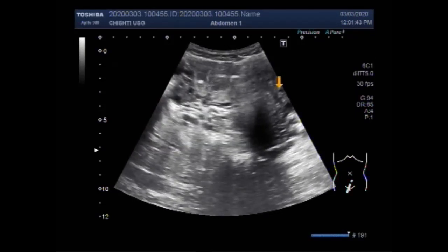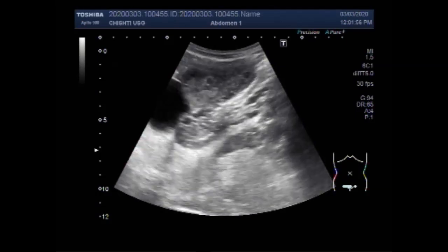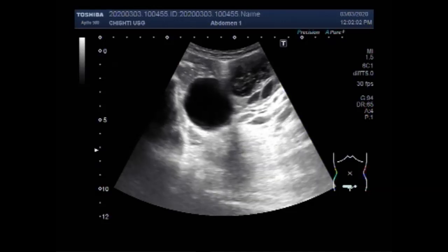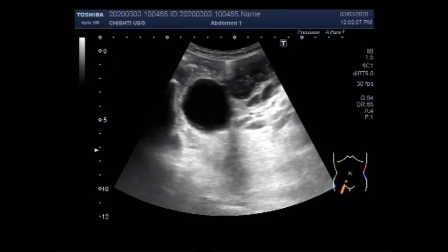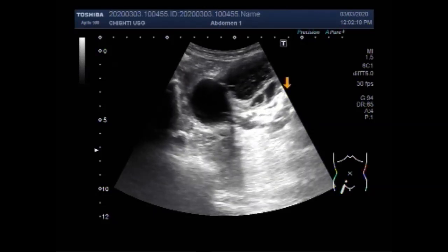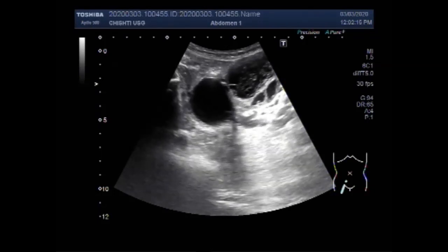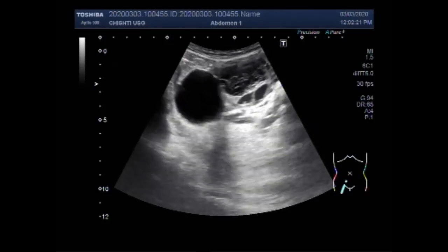This is the uterus and this is the left ovary. Both cysts are seen on the left side in the left ovary. One has a clear fluid interior, and the other has a turbid and thick fluid — that is a hemorrhagic ovarian cyst.